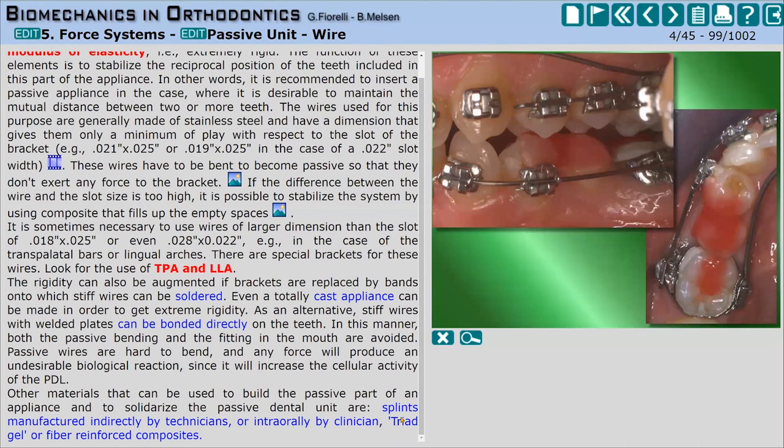And the other important thing is that you can use, and it's very, very important, your palatal arch and lingual arches to connect the posterior teeth on the two sides rigidly, and this extends your reactive unit to a larger number of teeth. So there are several ways to make a consolidation of the teeth, and as I say, this can be done both for active and reactive units.